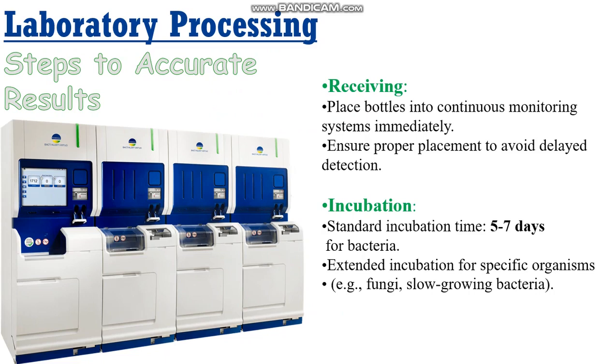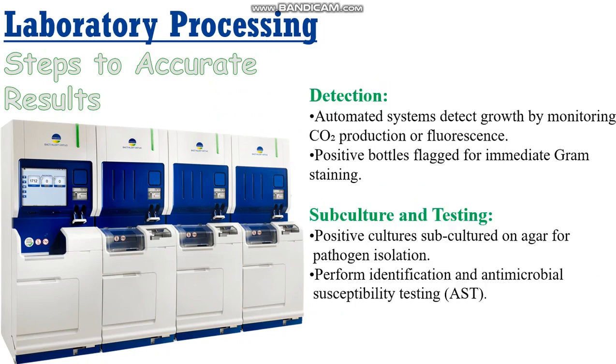Incubation times vary depending on the suspected organism. For most bacteria, a standard incubation period of 5 to 7 days is sufficient. However, extended incubation may be required for fungi or slow-growing bacteria like Brucella. Modern automated systems monitor bottles for signs of microbial growth. These systems typically detect changes in CO2 levels or fluorescence as indicators of organism metabolism.